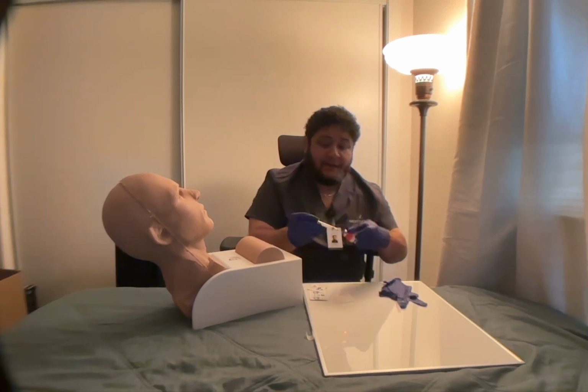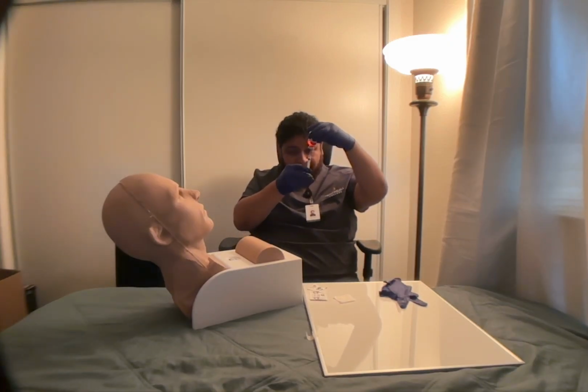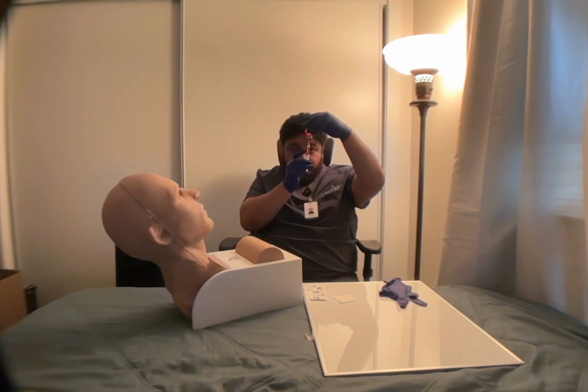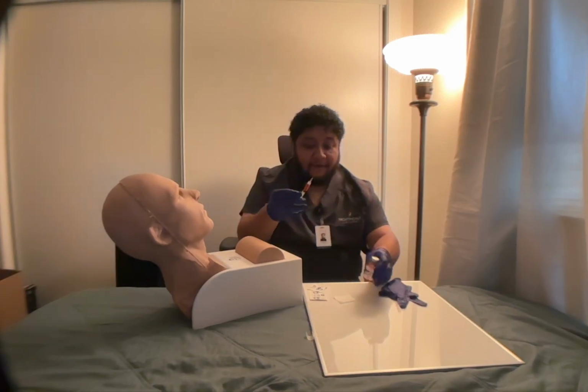And now I'm going to invert the vial, and I'm going to draw 1.5 milliliters of morphine. And now I just got to push any air bubbles out, and then remove the vial.